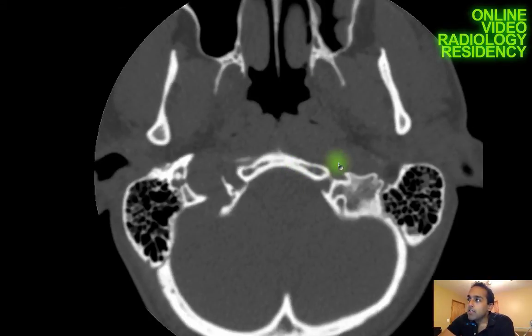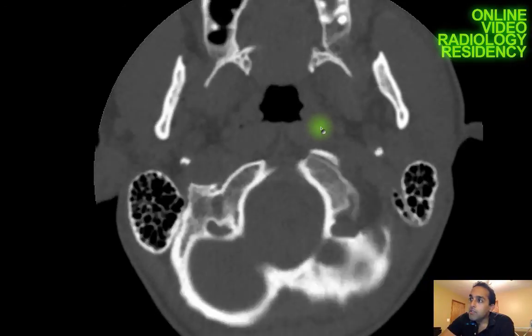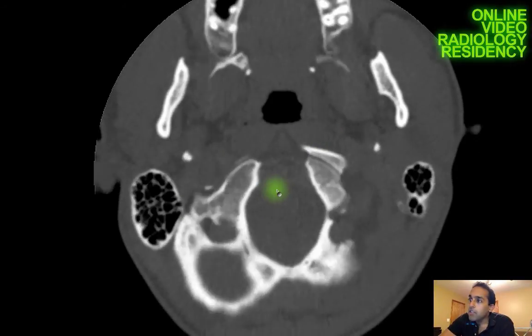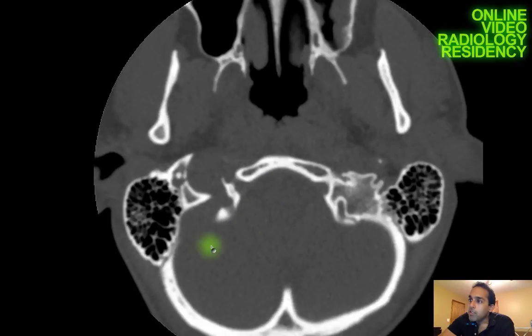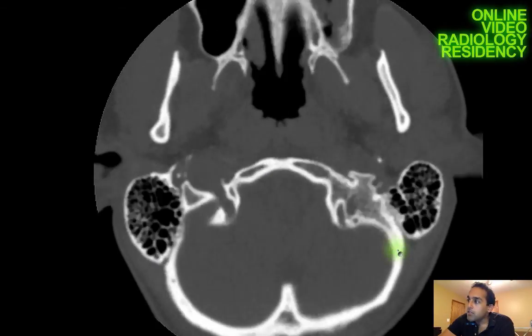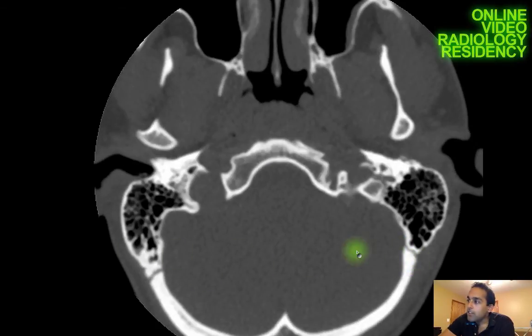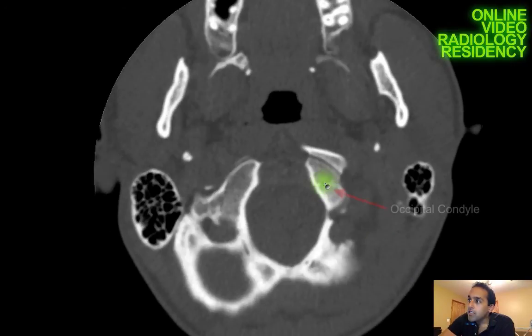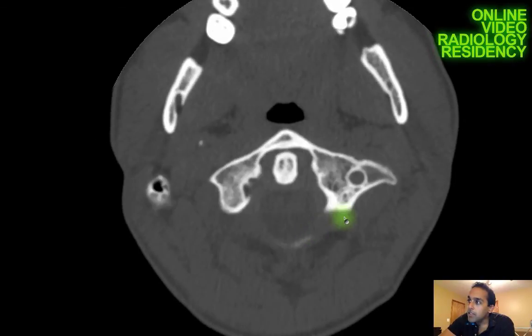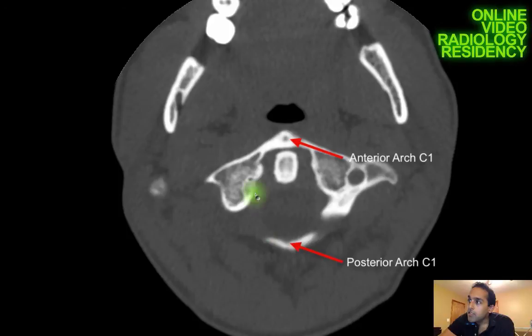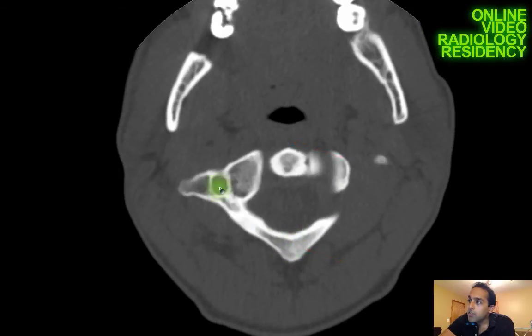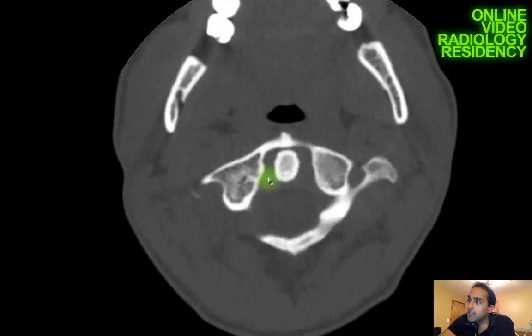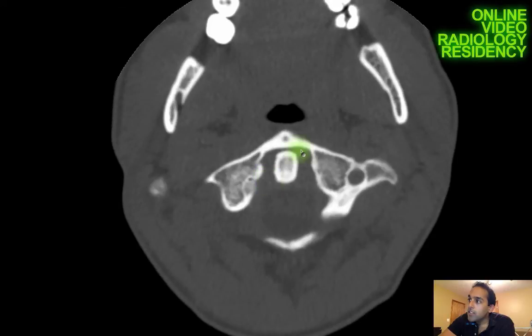Lastly, I go to the axial images, which give the most sensitive evaluation for fractures. I go level by level. I want to point out the occipital-mastoid suture — definitely don't mistake that for a fracture, as it's bilateral. Coming down, I can see the occipital condyles and the foramen magnum in the axial plane. Moving into the C1 ring, I can see the anterior and posterior arches and confirm everything is intact — so there's no Jefferson fracture.